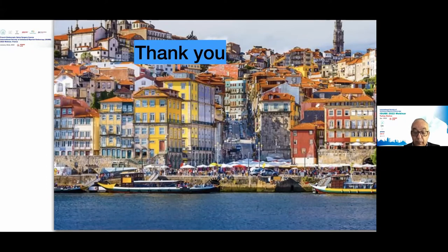For me, another difference from microsurgery is, for example, when we want to decompress from the opposite side, like we saw before, we have a much better image than in microsurgery, which allows us to perform a good decompression with more safety. We did not need to push the dural sac to see the other side. So I think that UBE is an excellent technique for spine surgery.